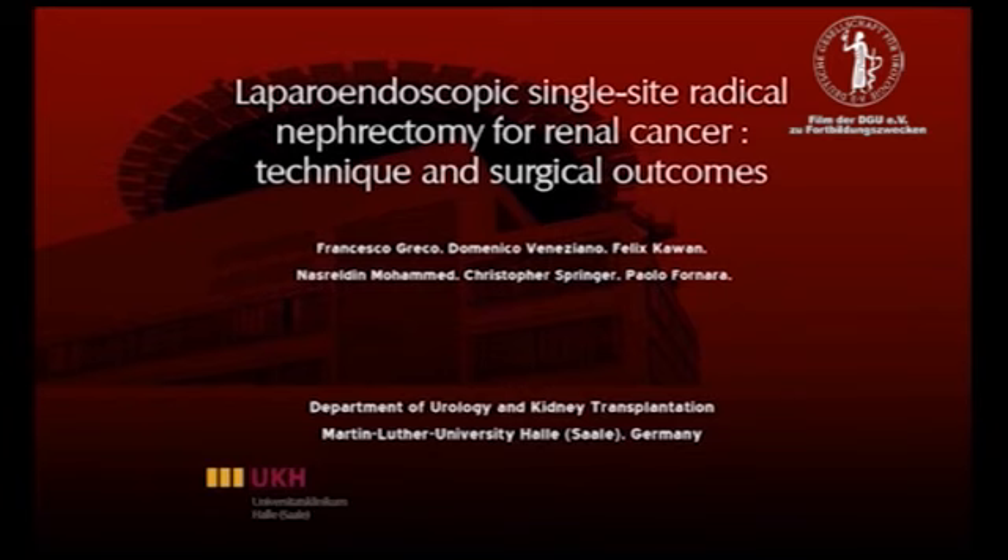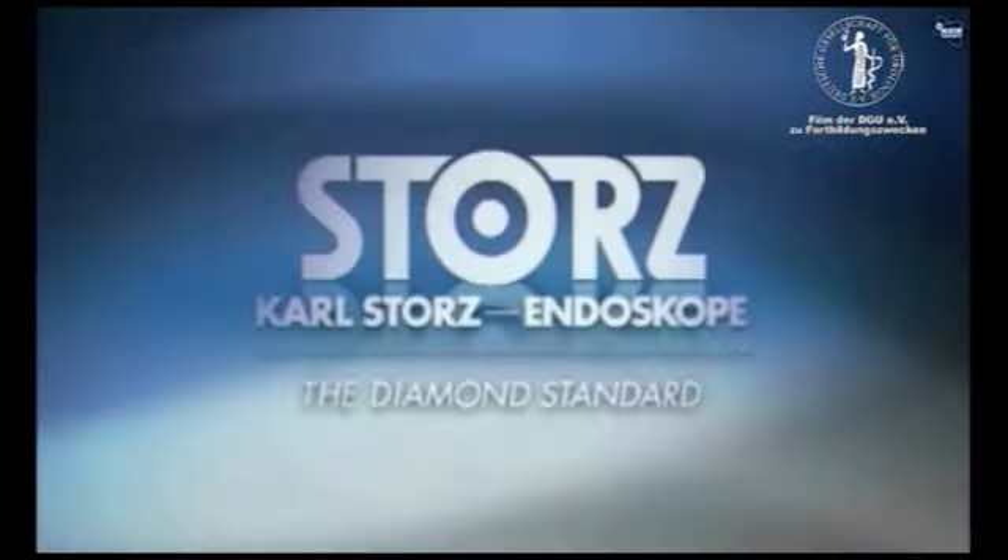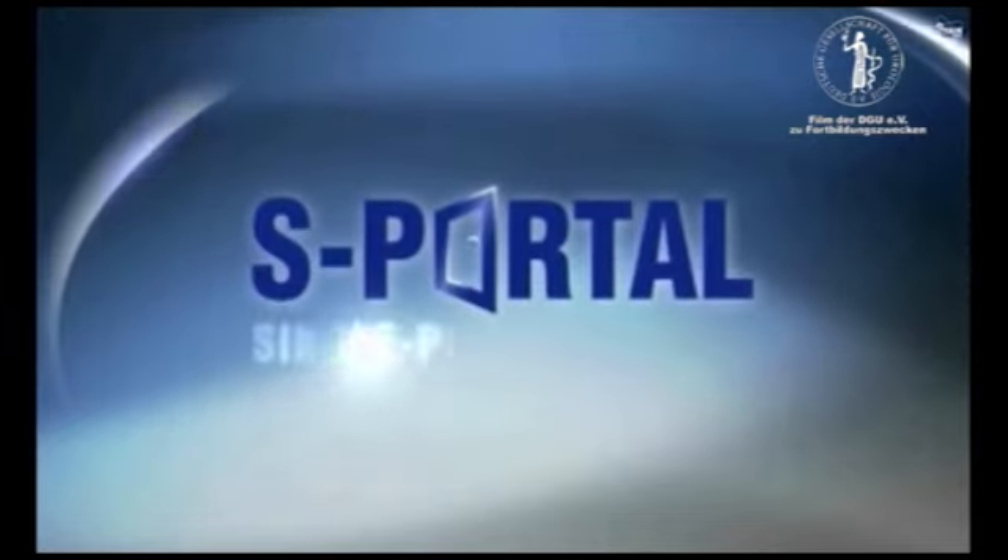In this video we will show our laparoscopic single-site nephrectomy technique, based on the latest Storz EndoCone, the S-Portal.